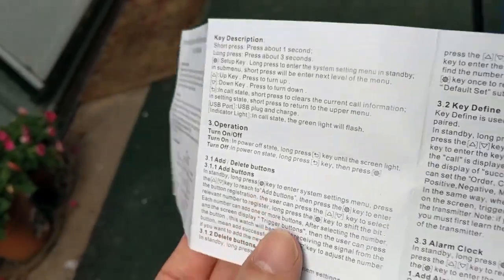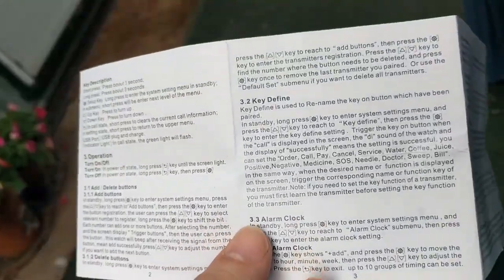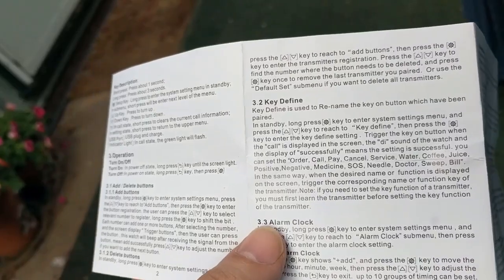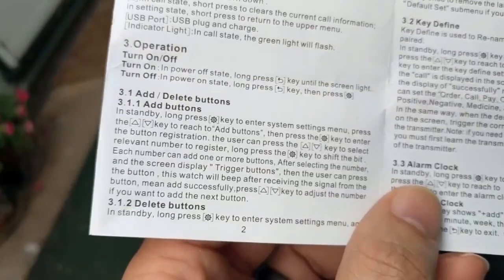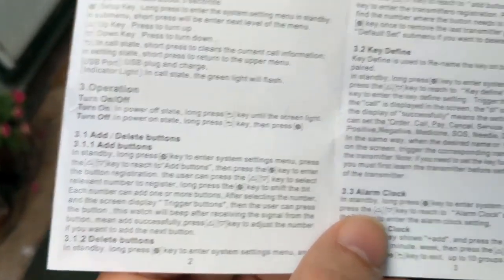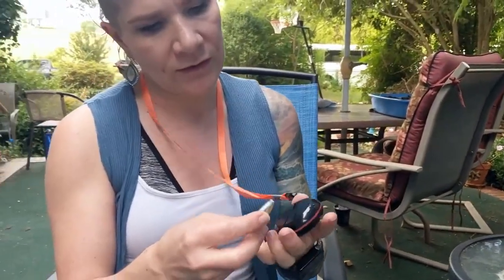Essentially there is your simple operation - things like turn on - and then there's add and delete buttons, so apparently you can add other functions or add other things to it. And then renaming those, key defines, and whatever else, and there's an alarm clock. This doesn't look simple and you would have to play with it to get an idea of what it actually does. We have this lovely 3M double coated tissue tape.